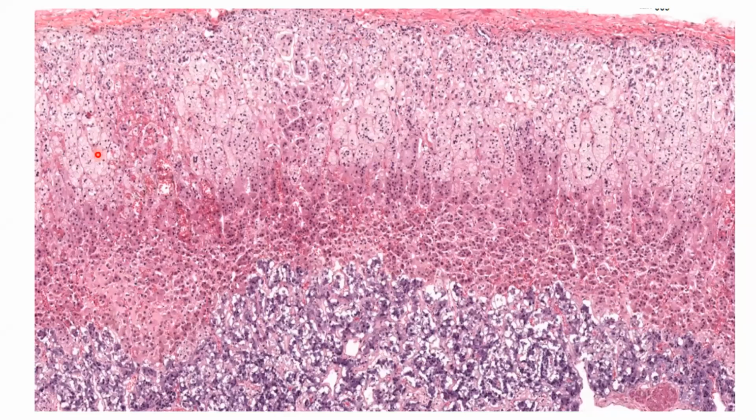parenchyma, adrenal gland's parenchyma. This parenchyma is having the cortex until this cortex, adrenal cortex, and this the dark stain one. This is the adrenal medulla. So adrenal cortex contains this outer until this layer is called the zona glomerulosa. This layer is the zona fasciculata, and this part is the zona reticularis. So zona glomerulosa, zona fasciculata, zona reticularis, and this adrenal medulla is there. And this adrenal medulla contain the chromaffin cells.